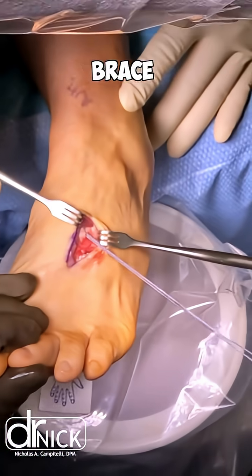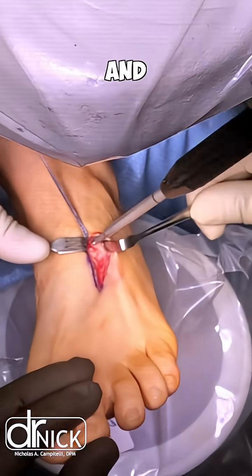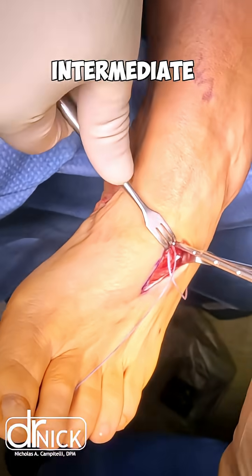We then reroute the internal brace dorsally so that we can repair or squeeze together the medial cuneiform and the intermediate cuneiform. Here you can see we're putting a swivel lock into the intermediate cuneiform.